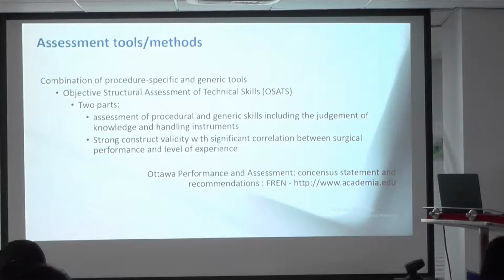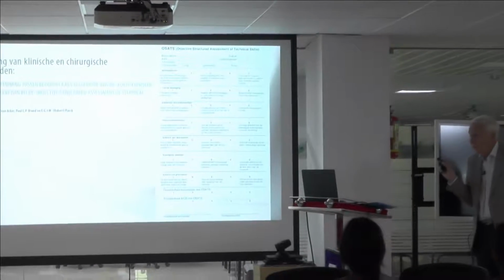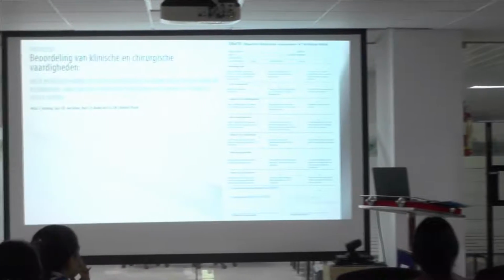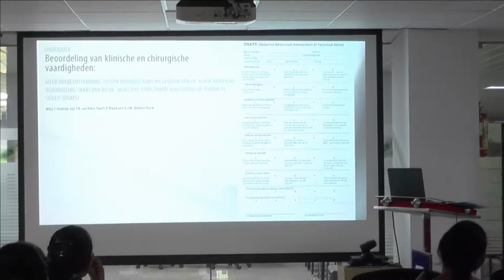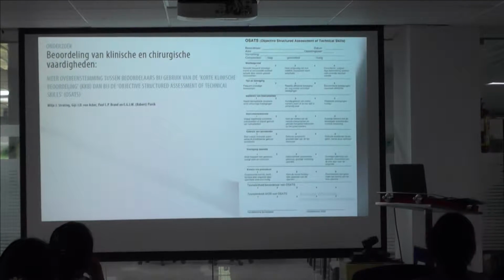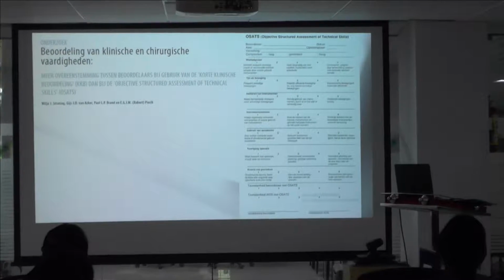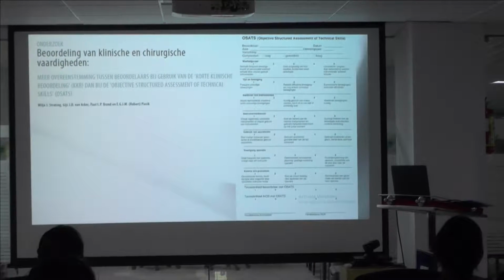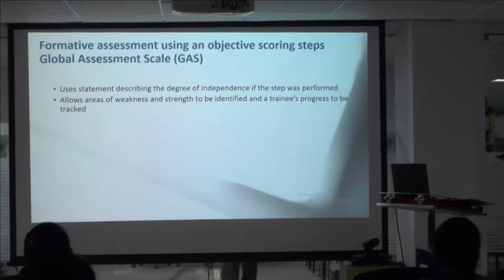That is a tool that is used in the training program of surgeons in Netherlands as obligatory. You need to have at least 10 to 20 within each year of your training from different procedures in your portfolio before you can sign off the year. It is pretty easy to handle.